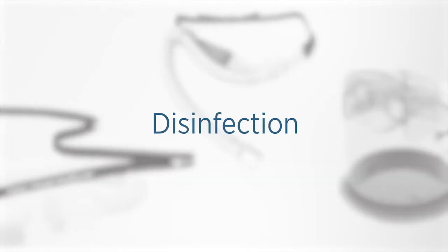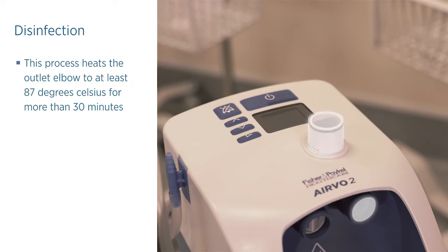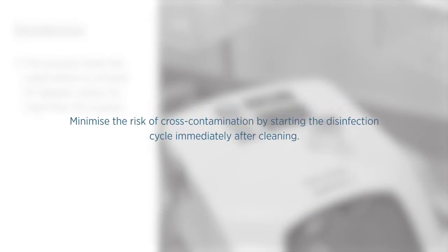The next step is high-level disinfection using the red disinfection tube. This process heats the outlet elbow to at least 87 degrees Celsius for more than 30 minutes. Minimize the risk of cross-contamination by starting the disinfection cycle immediately after cleaning.